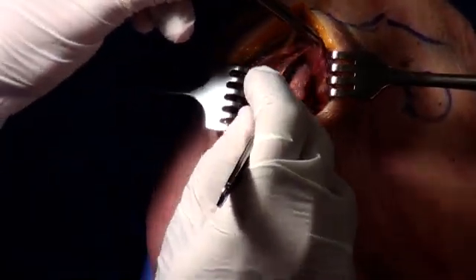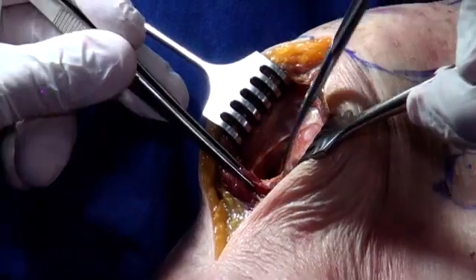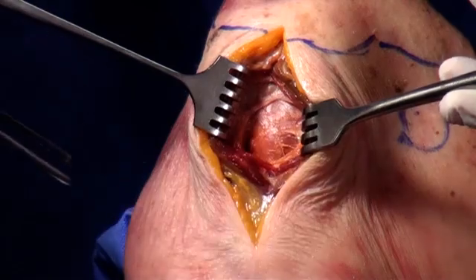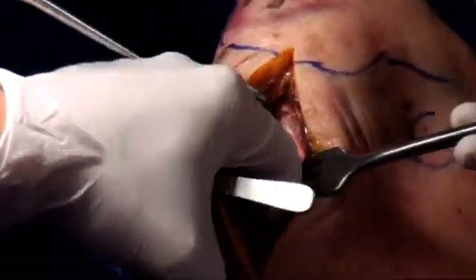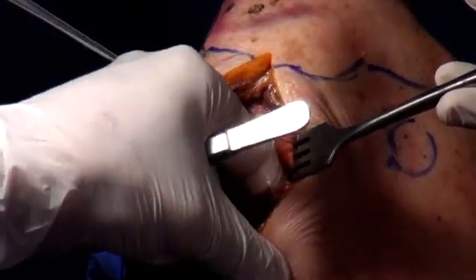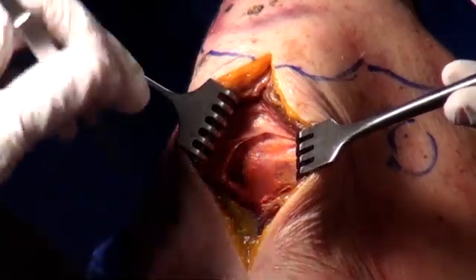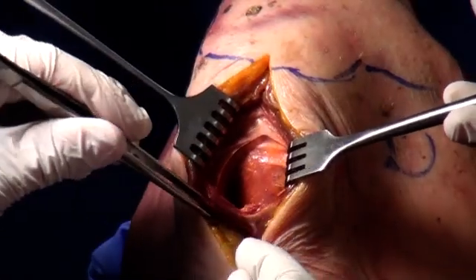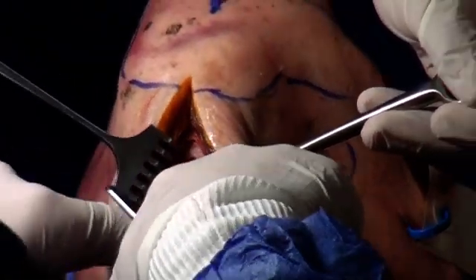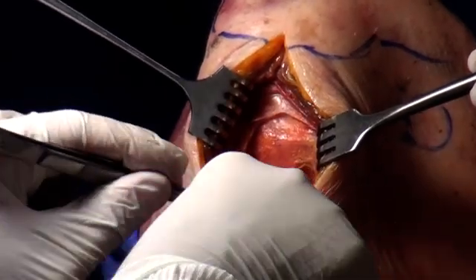Now we've gone through the deltoid and we're opening the bursa. Once you go into the bursa, you need to put your finger down there and feel the reflection. Once you open the bursa, that's where the axillary nerve is. We can extend a little bit if you want to expose the axillary nerve. So that's the nerve there — now we can see it clearly, and we're not afraid of it.